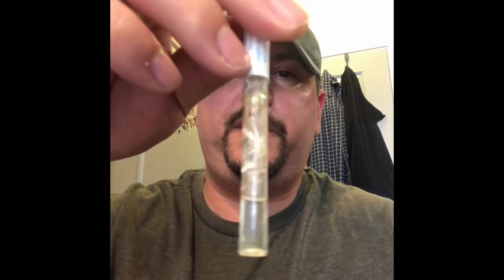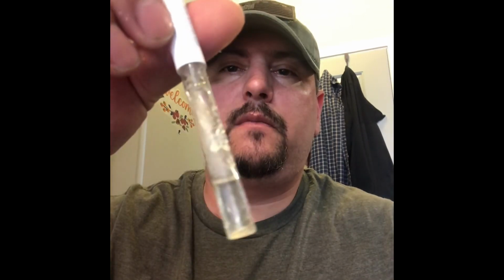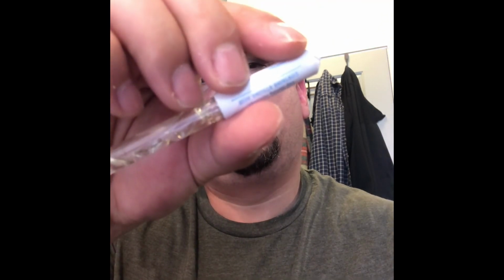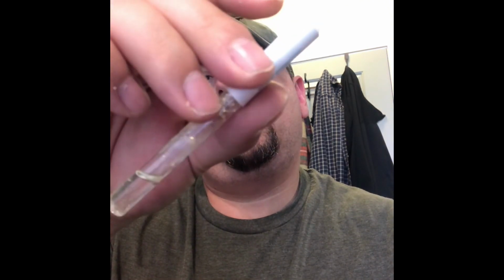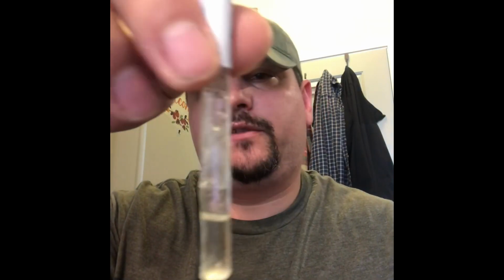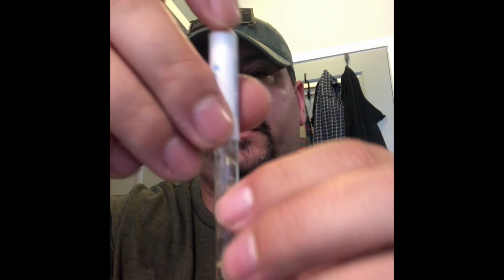But if my memory serves me correct, it might have actually been purple too. But different drug test, different company. This is ODV, whatever that is. So anyway, it's nothing. There's no color. There's nothing in here. I really just want to see if they're going to change color at all.